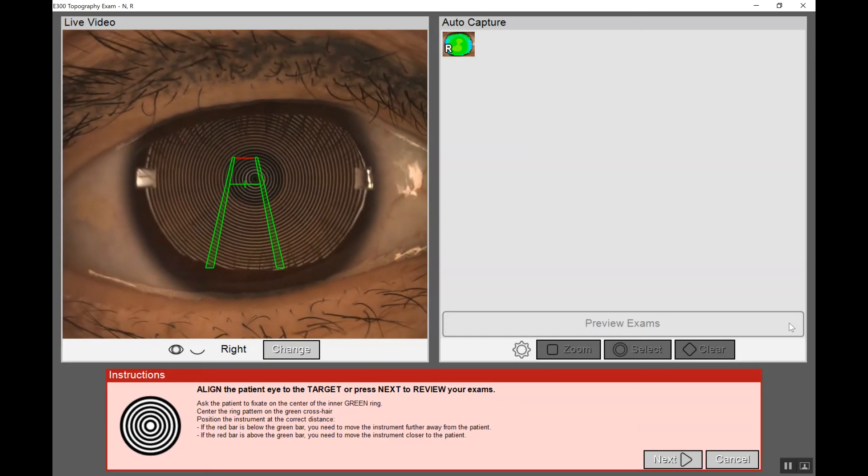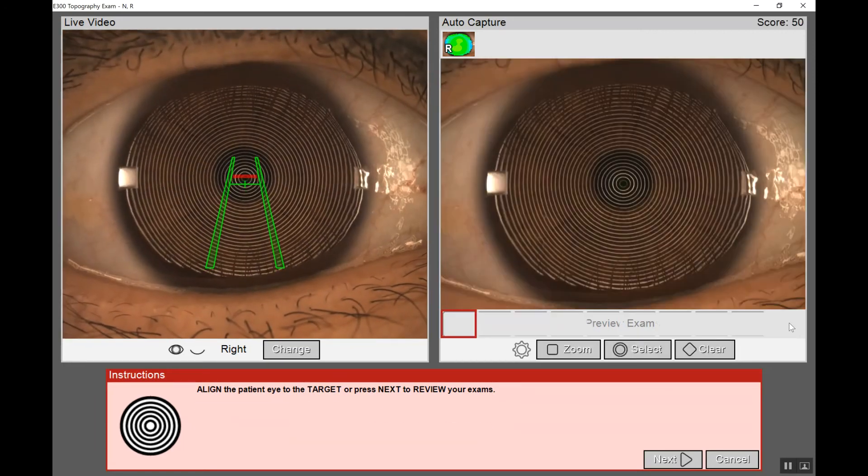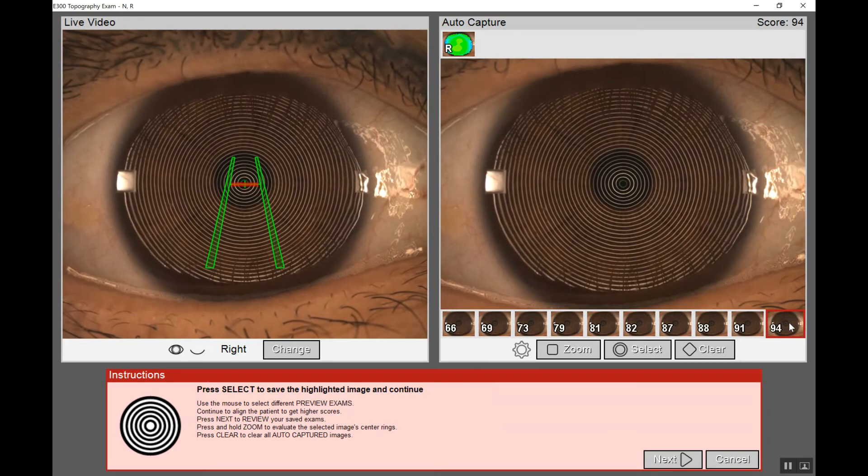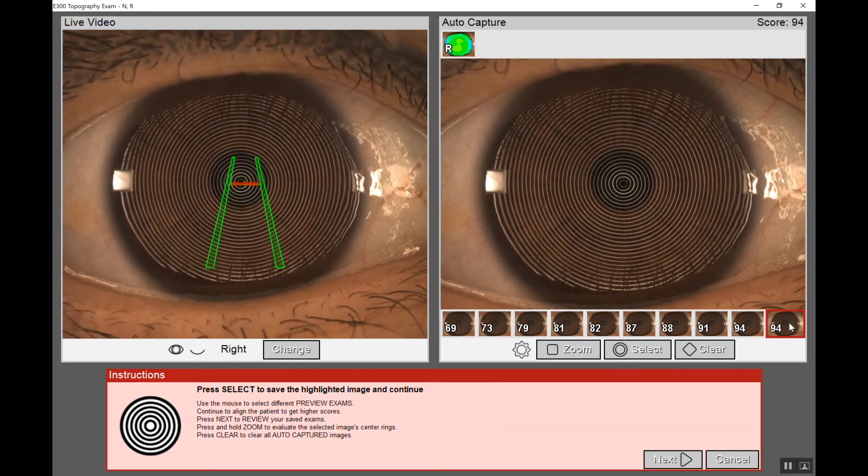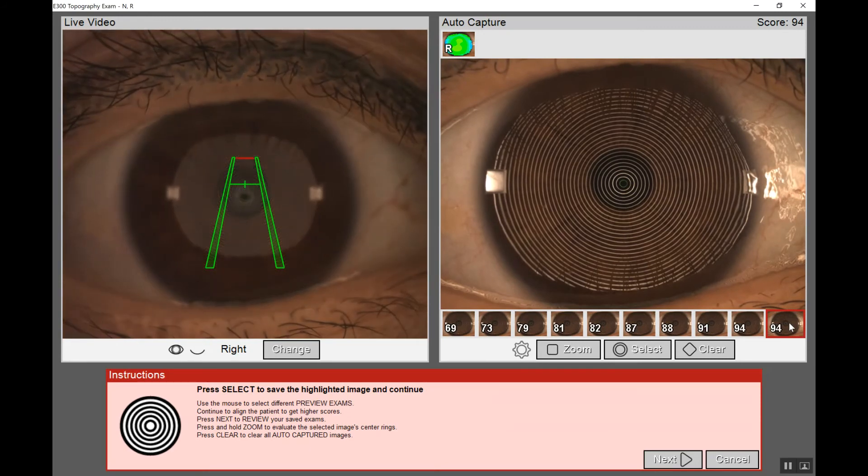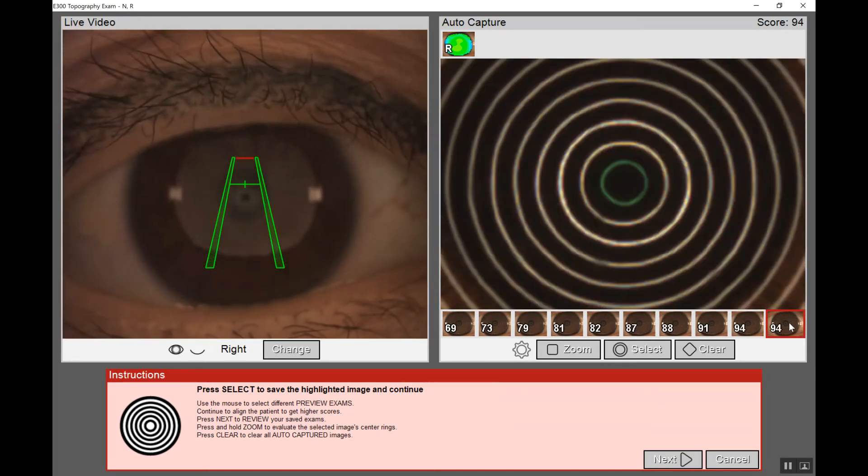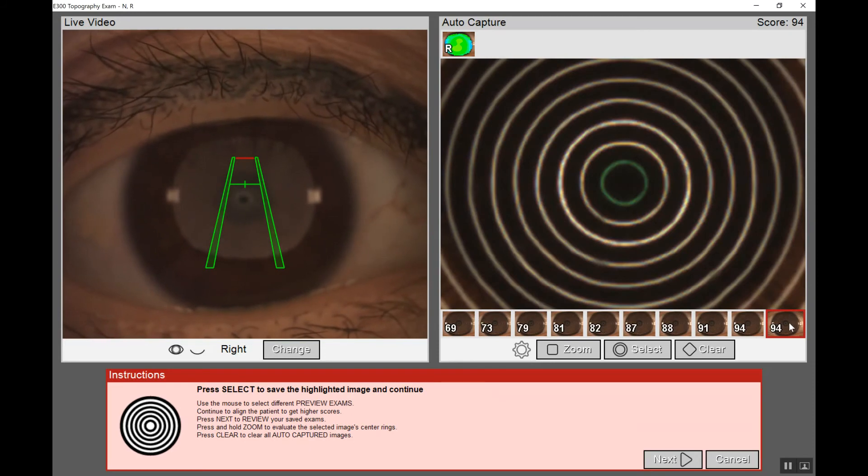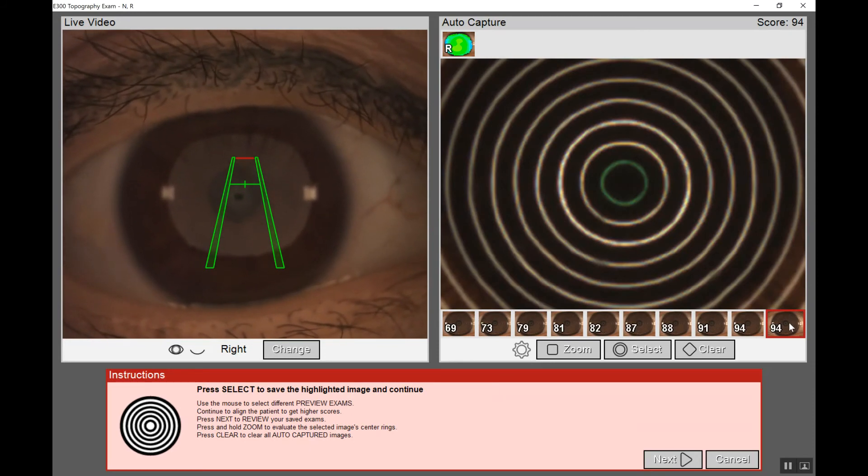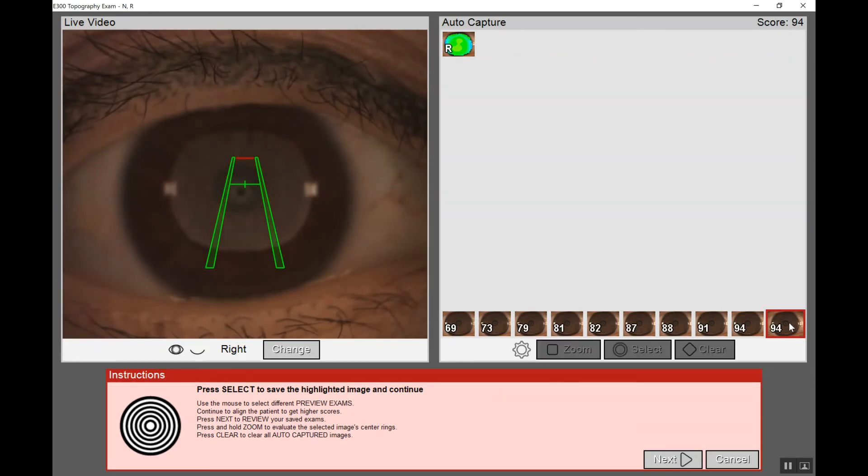Let's take one more. We'll ask the patient to open up wide. We'll try to center to get a 90% or better, which we've done. Again, we'll zoom in, ensure the rings look parallel and even. If so, then we'll click select.